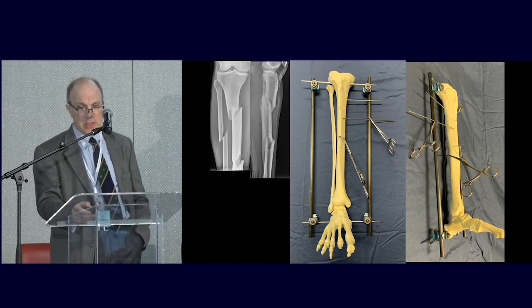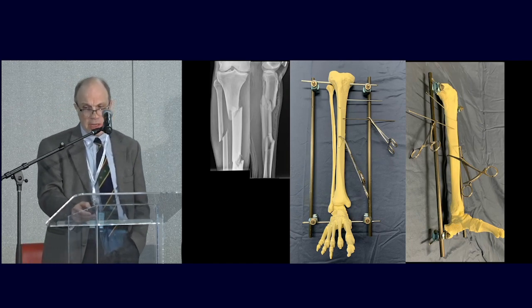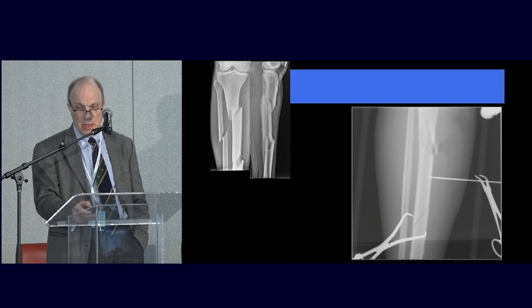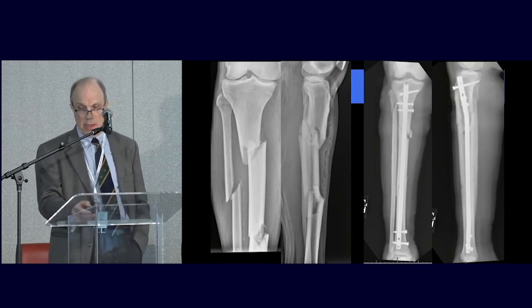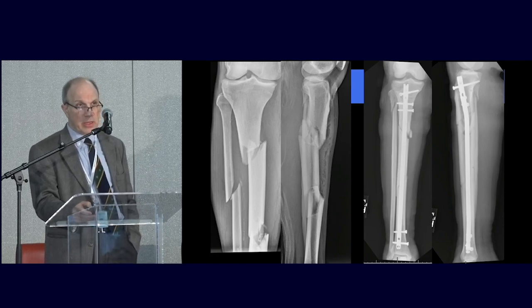The distal fracture is less comminuted. Is it clampable? I thought that we may be able to. Again, these are all plans. It may or may not work during the case, and you may change your plans or have a plan B. And as you can see, during the case, we clamp the distal fragment, and to control the segmental fragment, we are using a unicortical pin of the X-fix, and we are able to get a pretty good reduction and hold the reduction throughout the case.